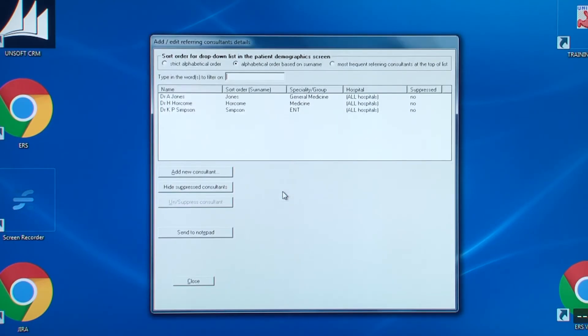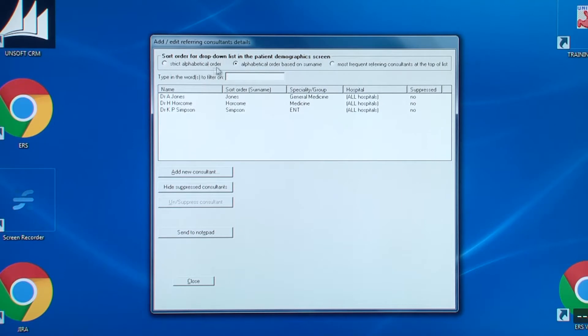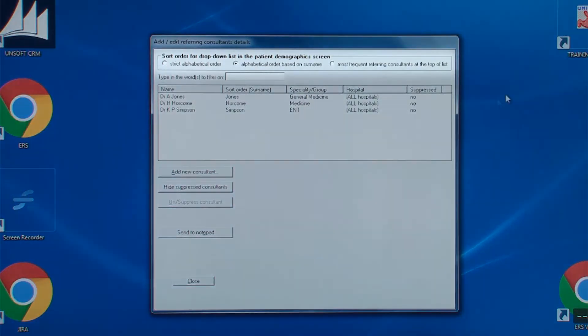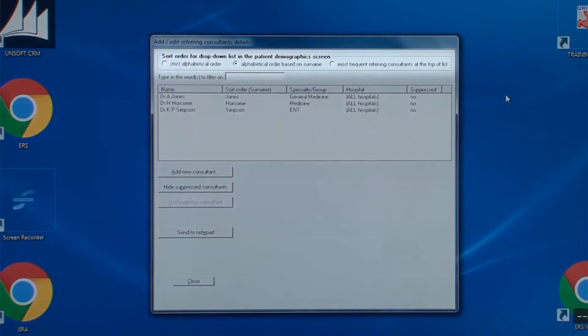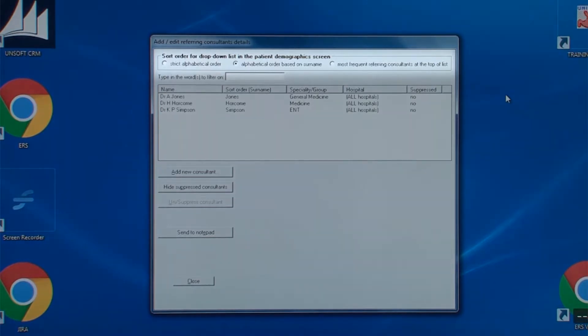You see their specialty and which hospital they belong to. The first point to note is the top line. You can set the order by which you want the referring consultants to be displayed in the drop-down boxes on the patient demographics screen. You can have them in very strict alphabetical order or orders in alphabetical order of surname. Or you can have the list displayed with the most frequent referrers at the top.